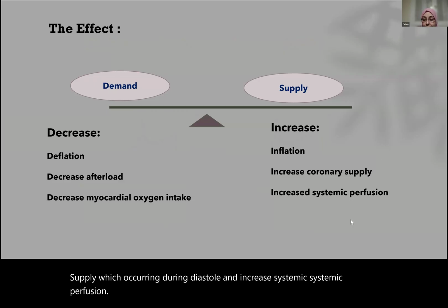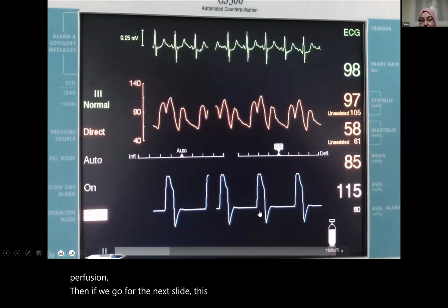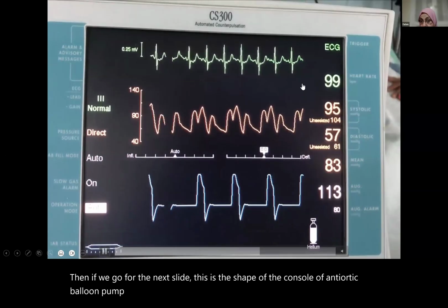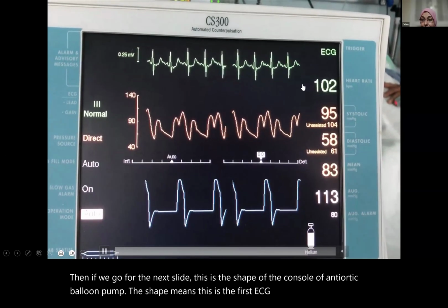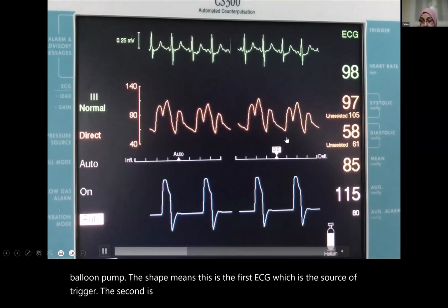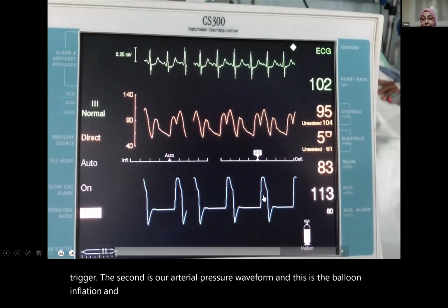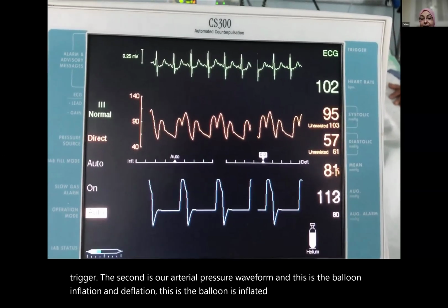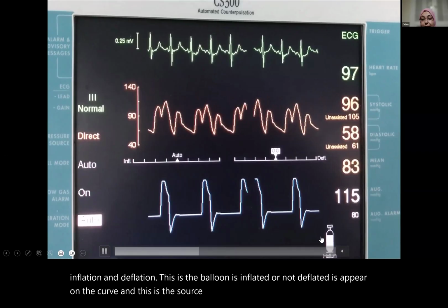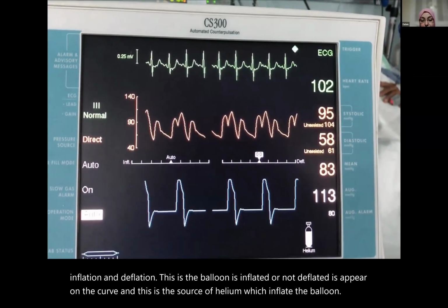If we go to the next slide, this is the shape of the console of the intra-aortic balloon pump. The first is the ECG, which is the source of the trigger. The second is our arterial pressure waveform, and this is the balloon inflation and deflation. Whether the balloon is inflated or deflated appears on the curve, and this is the source of helium, the gas which inflates the balloon.